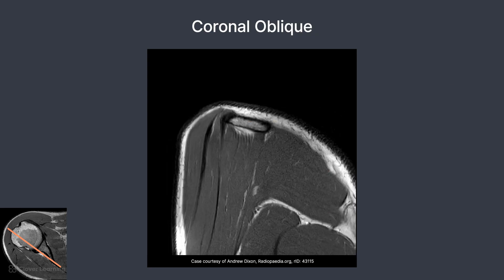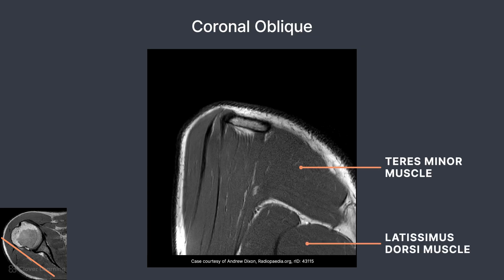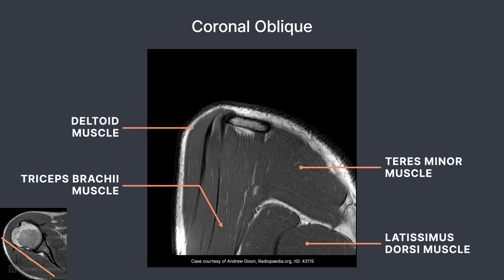On the last slice, muscles include the teres minor, latissimus dorsi, deltoid, and the triceps brachii. Let's move on to the axial plane of imaging.